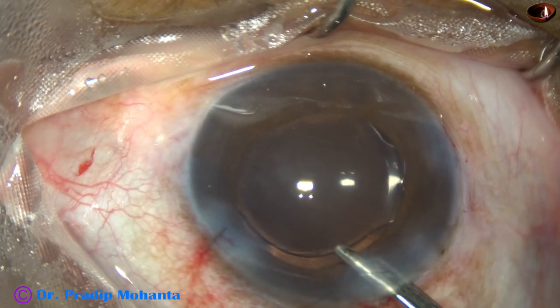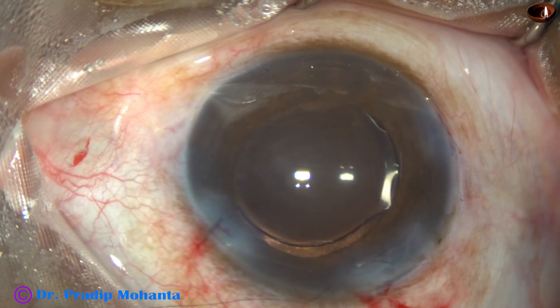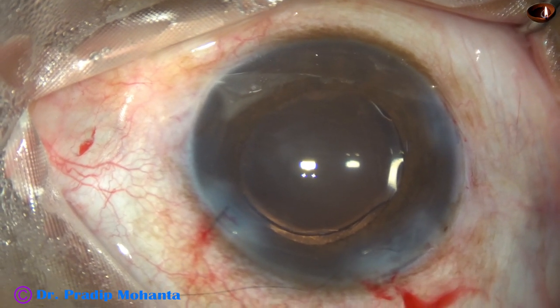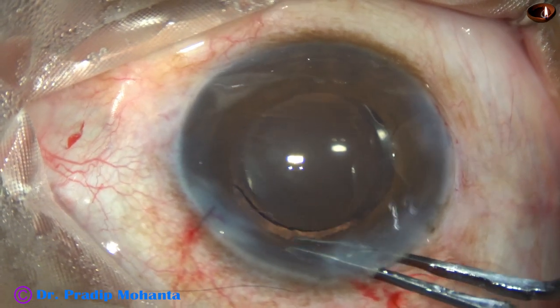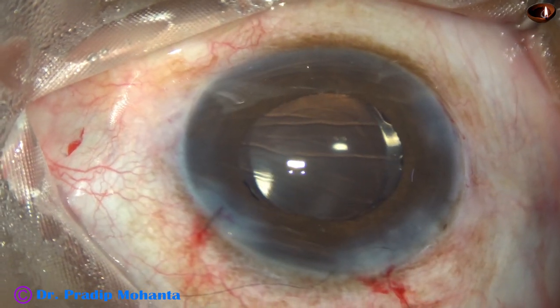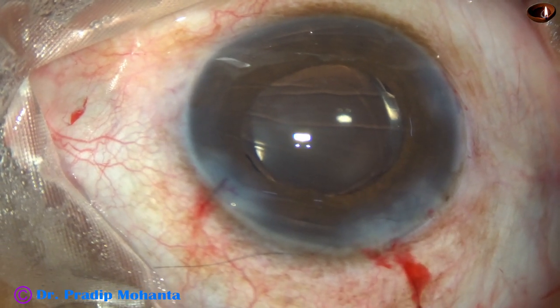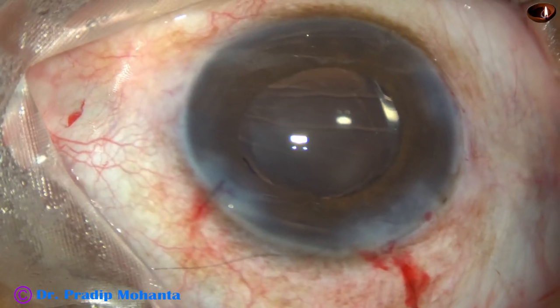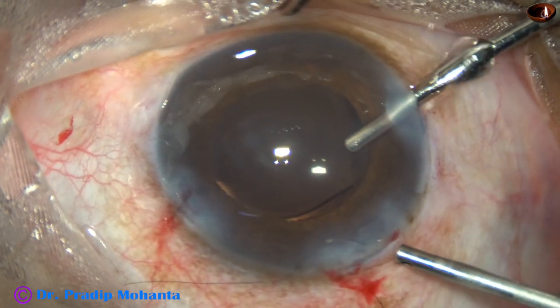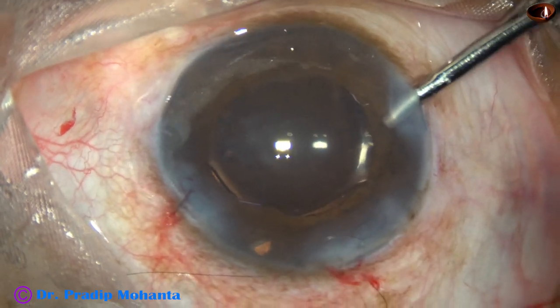I aspirate the air and find that the pupil has not constricted well. So I take the capsulorrhexis forceps — that is the Utrata forceps — and push and pull the iris to make some space. Now I put the irrigation through the 8 o'clock side port with the left hand, and with the right hand I do a small iridectomy at 12 o'clock.